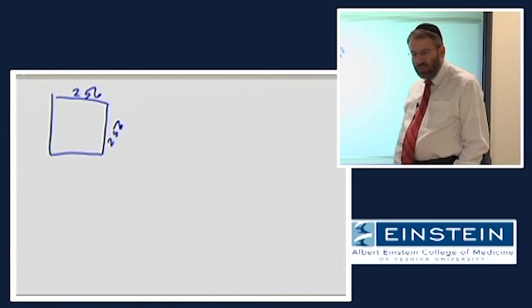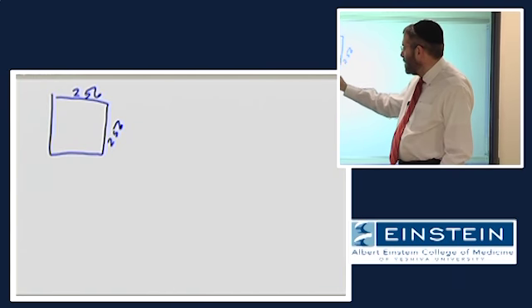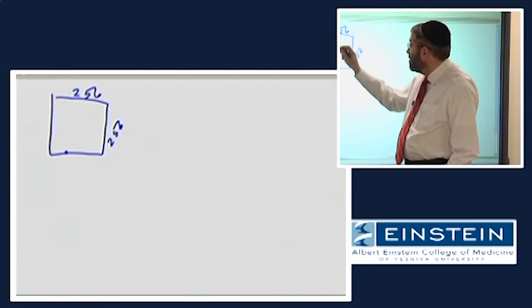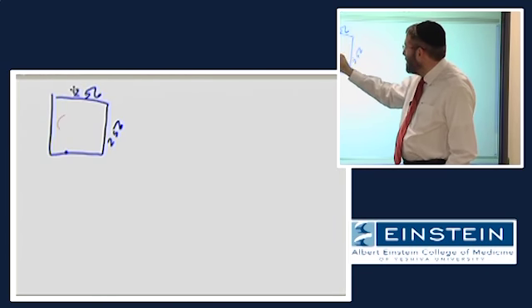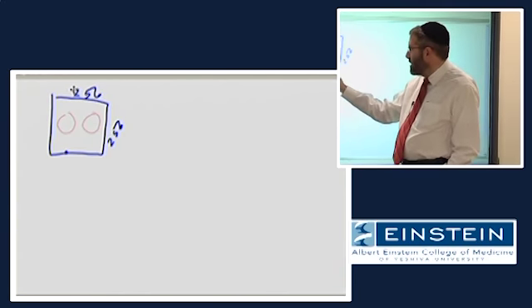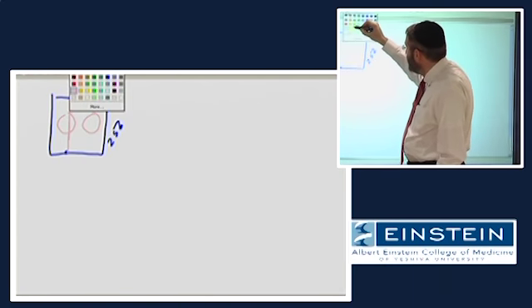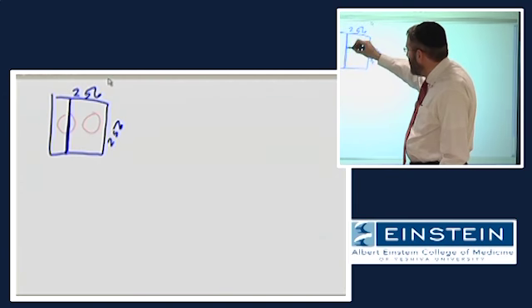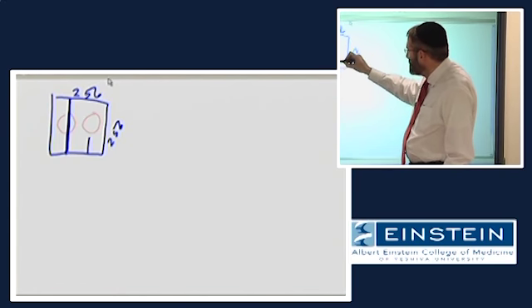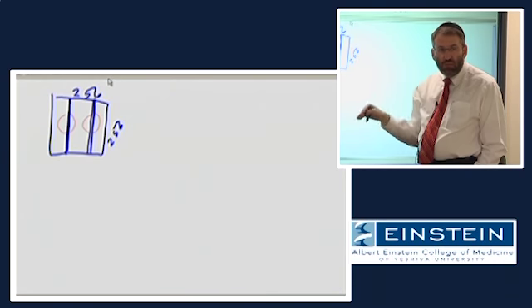So you have this sort of box of bars. You would be forced to basically say that, well, I know that at this location, this is the person's legs that we can't really see over here. So all we could say is that we know that at this location there's a maximal signal amplitude. But we would have to make that signal amplitude the same all the way from top to bottom, because there's no way for us to tell where the signal comes from in that direction.